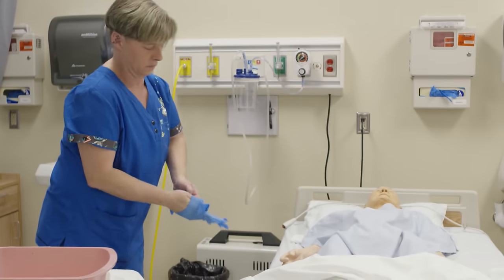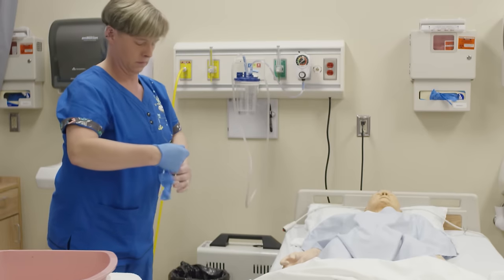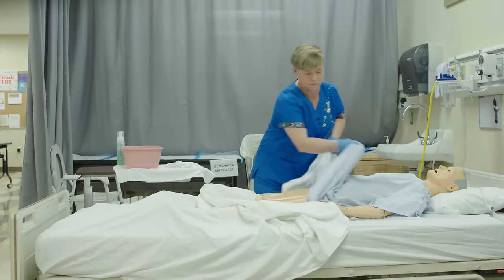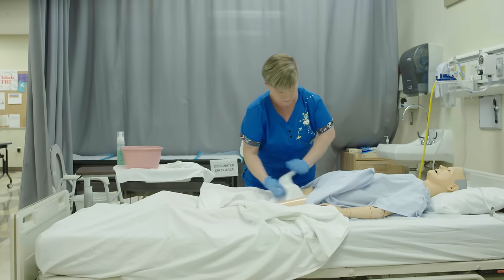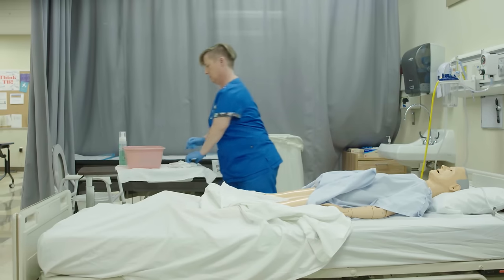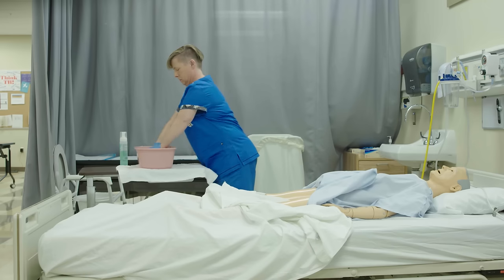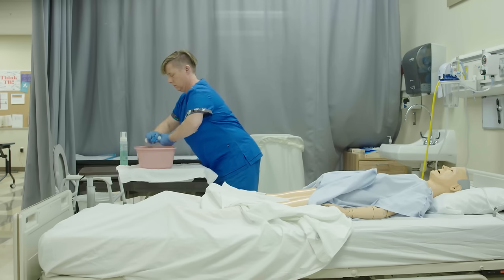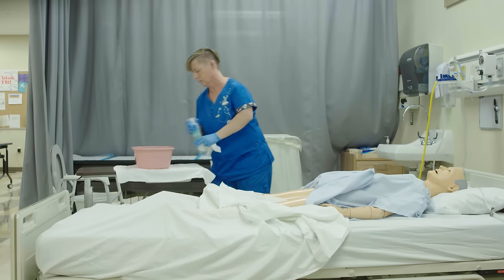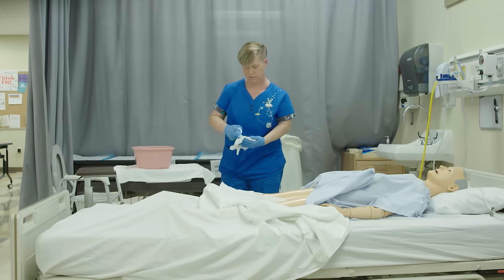The candidate puts on clean gloves before washing. The area surrounding the catheter is exposed while avoiding overexposure of client. The candidate places linen protector under perineal area before washing. Soap is then applied to the wet washcloth.